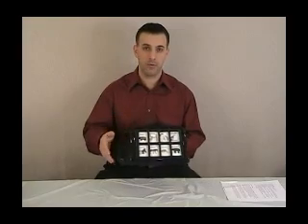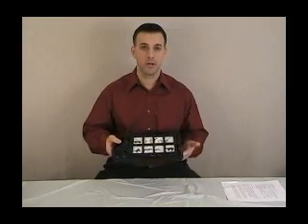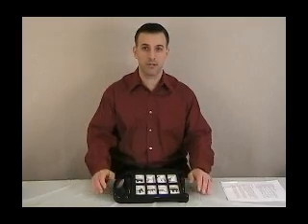This is exactly what would happen. It would cut off in the midst of your message. And if it was a battery issue, as soon as you replace the batteries, the message should play in its entirety.